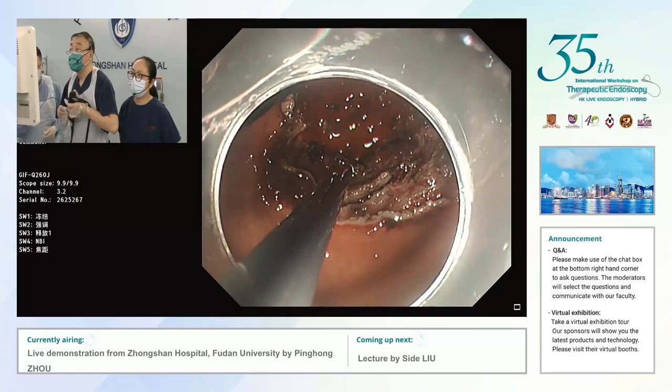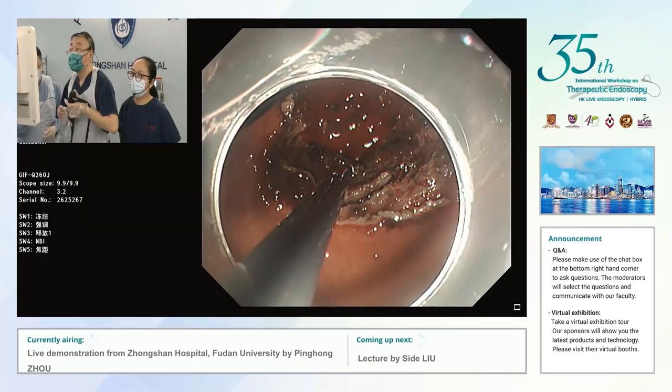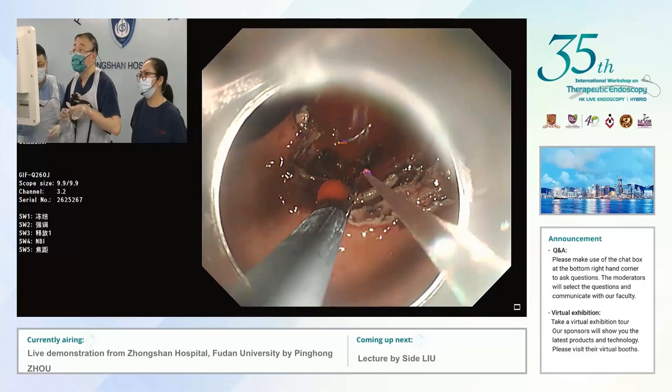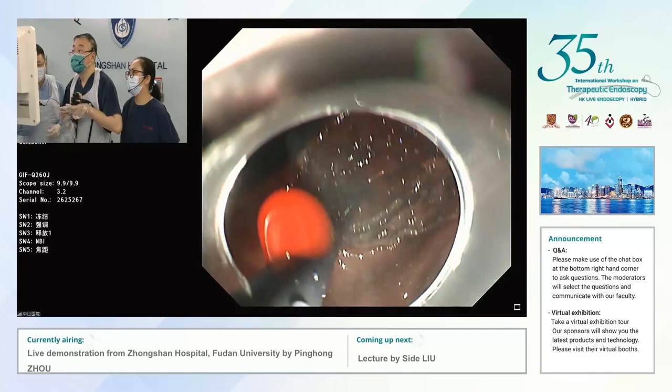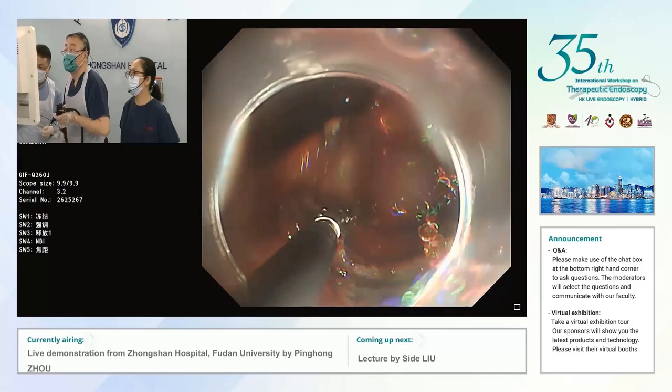Before our live demo, this case encountered very major bleedings during the procedure — a very difficult case. First I use the forceps to stop the bleeding. If that fails, I will use the clip.